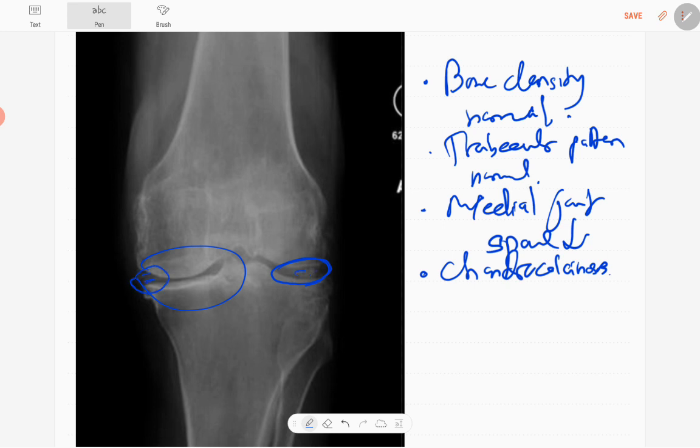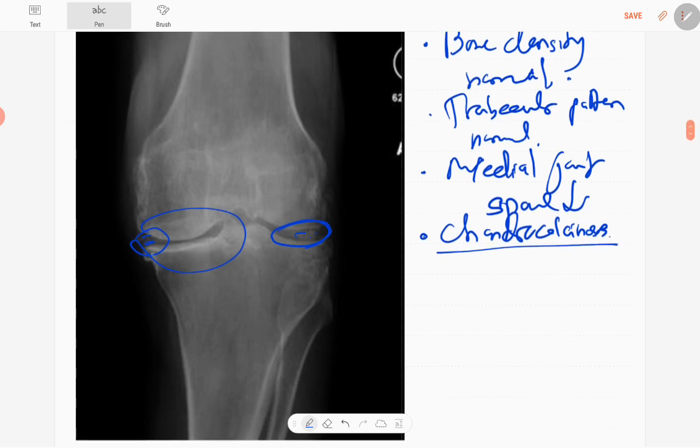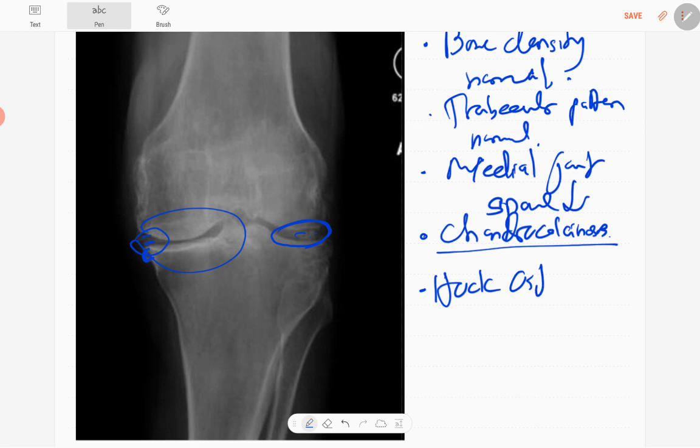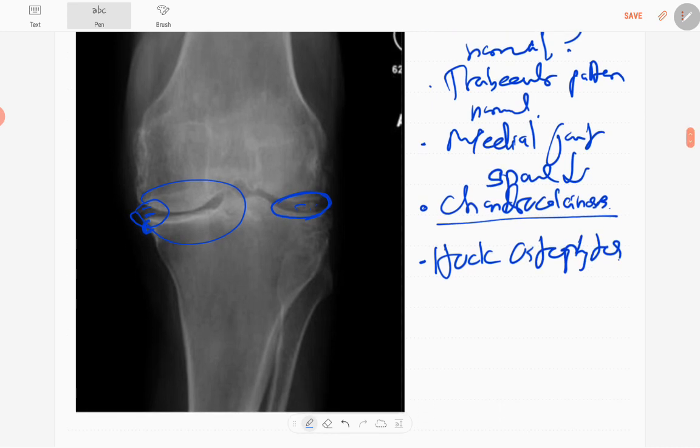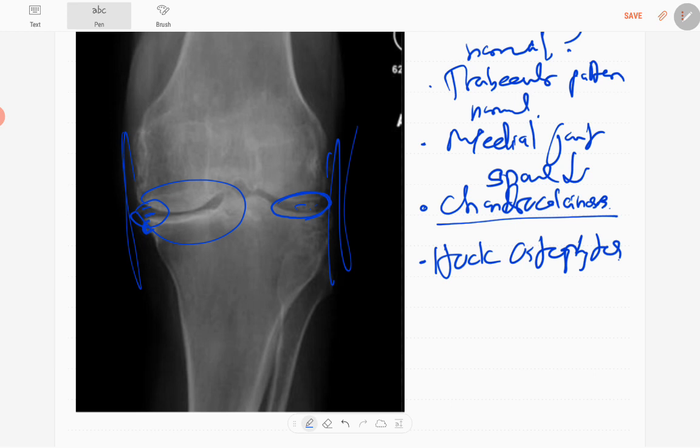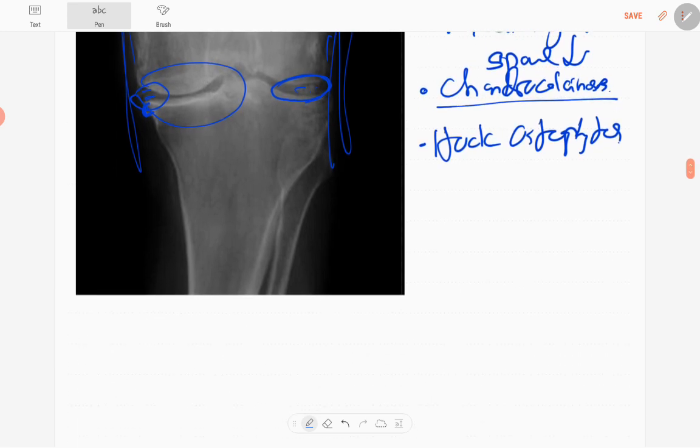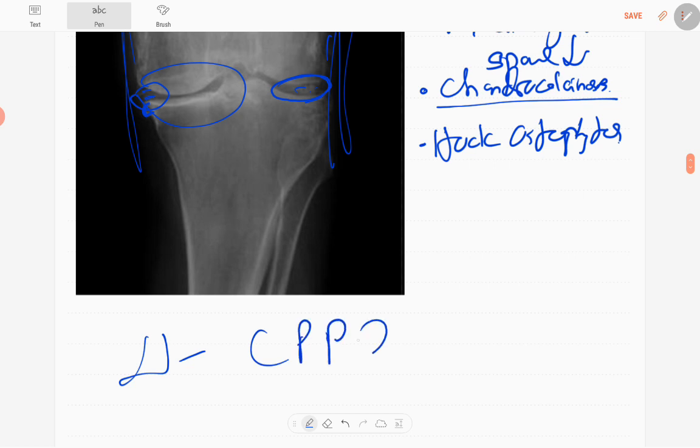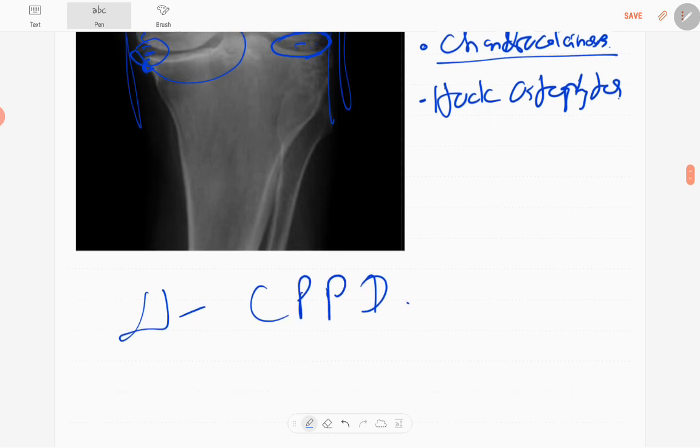This is called chondrocalcinosis. There is osteophyte formation - hook-like osteophytes are there. However, no ligamentous injuries, no dislocations, no fractures, no soft tissue findings. The diagnosis of this chondrocalcinosis is calcium pyrophosphate dihydrate deposition disease, CPPD, or pseudogout.